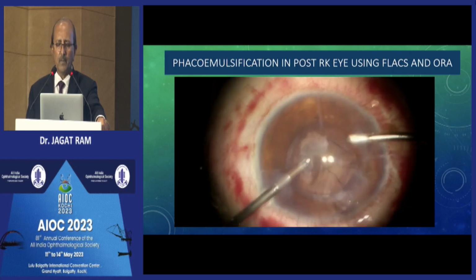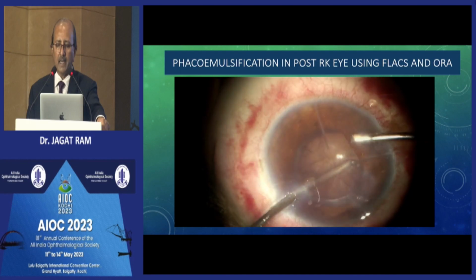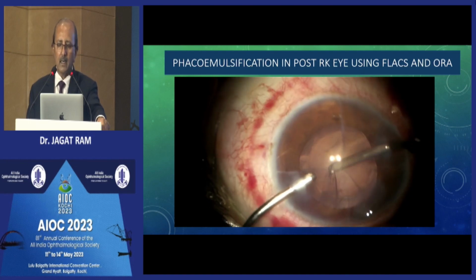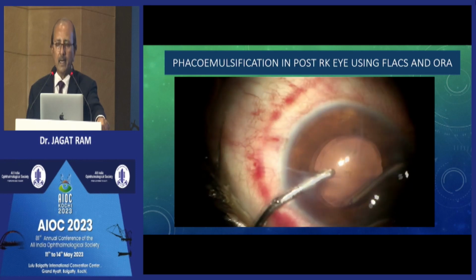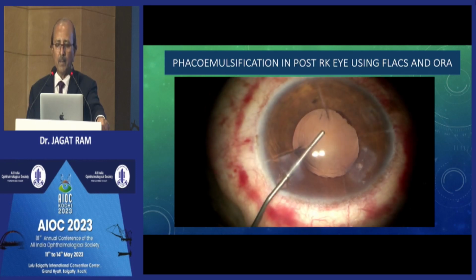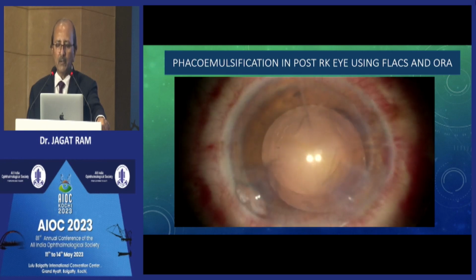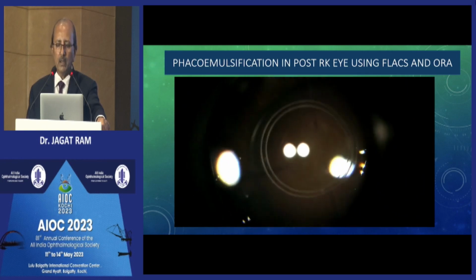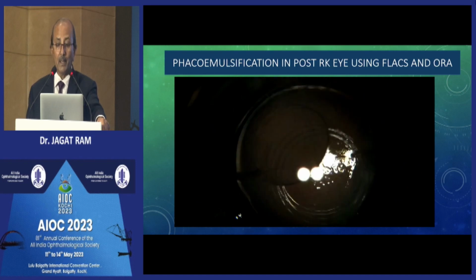Again, this procedure remains the same for any type of eyes, but particularly in radial keratotomy, particularly if there is a central haze, a corneal opacity in the center. In this patient, it is a clear visual axis, so no issue, no problem found. But otherwise, it may not even measure it.